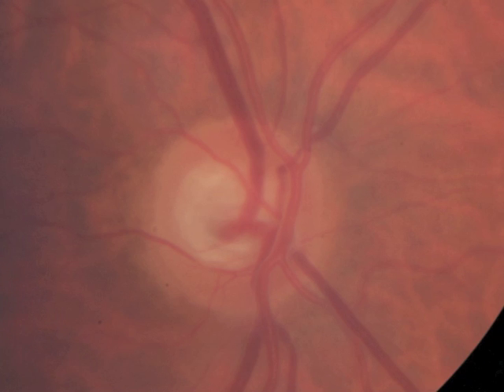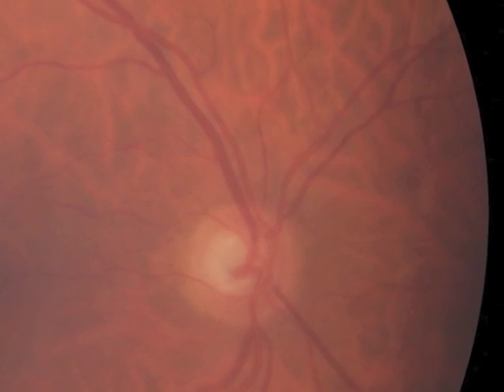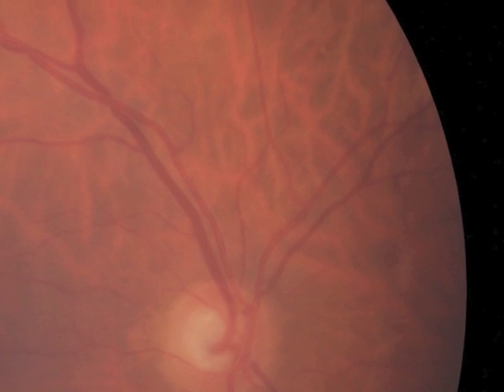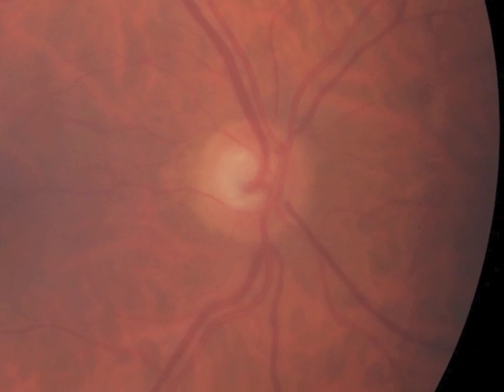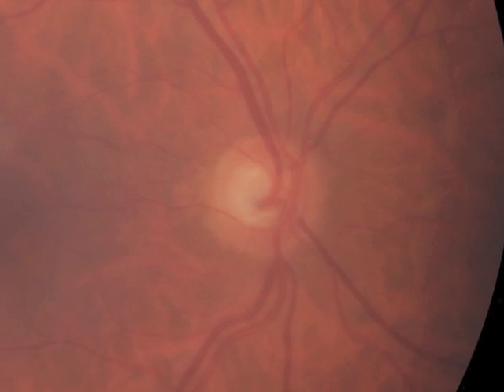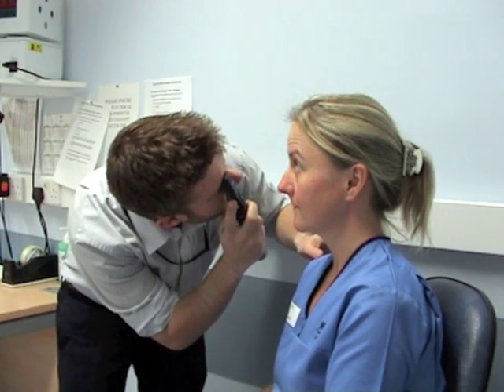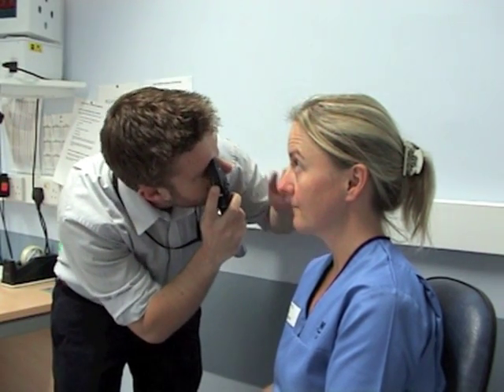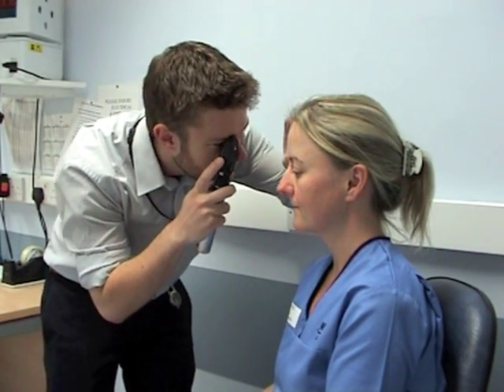So once again, the examination starts at the optic disc, then moving on to the supra-temporal arcade, supra-nasal arcade, infra-temporal arcade, infra-nasal arcade, and finally looking at the macula. It is important that when examining a portion of retina, one asks the patient to look in that direction and moves in the opposite direction. This brings the desired area into view and allows examination of more peripheral retina.